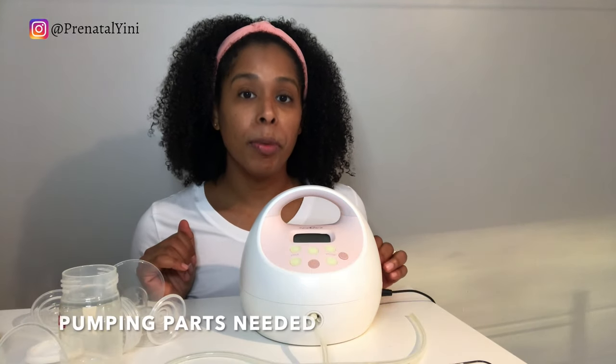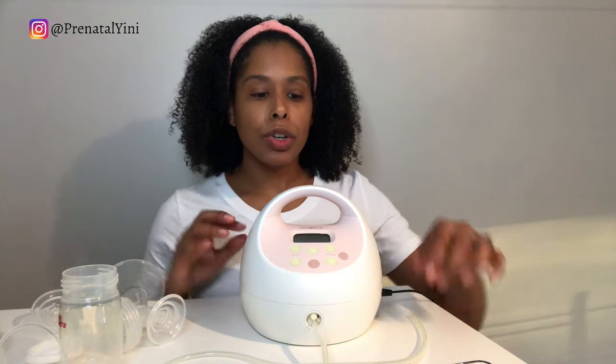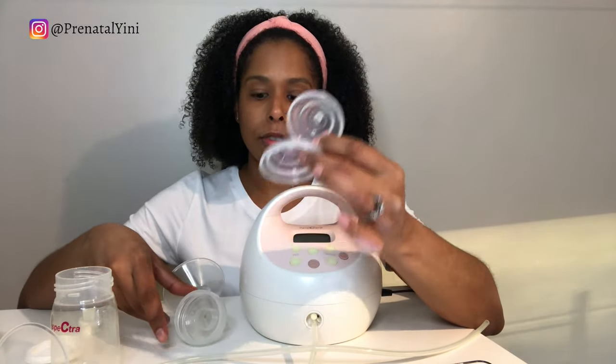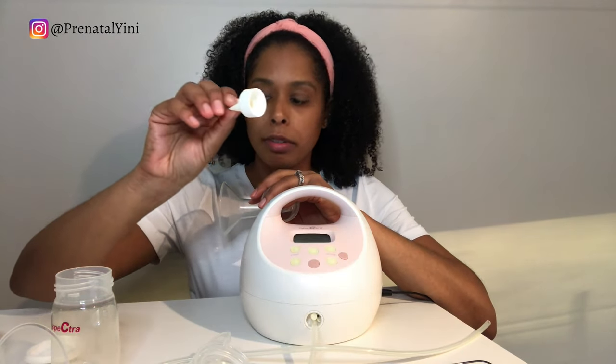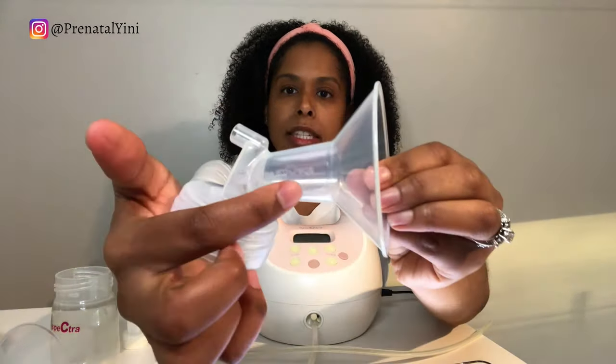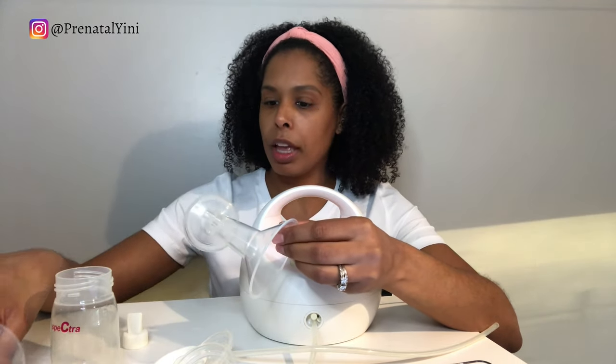Now let's talk about the parts. Your kit should come with two flanges, two milk containers, two sets of backflow protectors, two valves, two membranes, and two sets of breast shields in two sizes. A lot of moms think they get four shields all the same size — no. One set is 28mm and one is 24mm. A 24 is usually standard, but it's very important to be fitted for the right size.